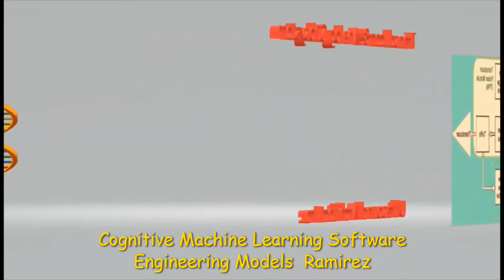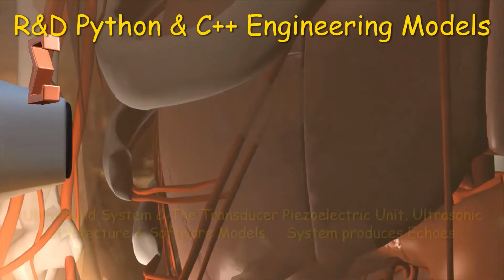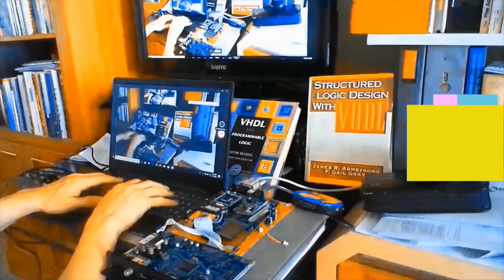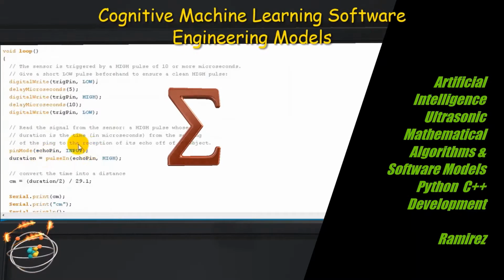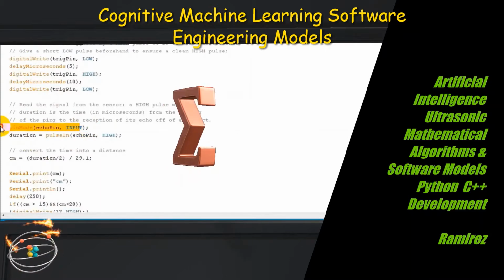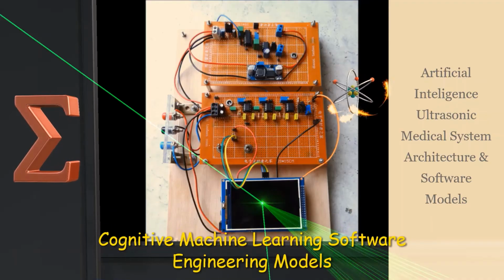The sound waves, like typical waves, are reflected at the interfaces between tissue of different acoustic impedance, that is linked to the density of the medium, where the strength of the echo is proportional to the difference of the impedance. On the other hand, echoes are not produced if there is no acoustic difference, hence no impedance interface between the media.